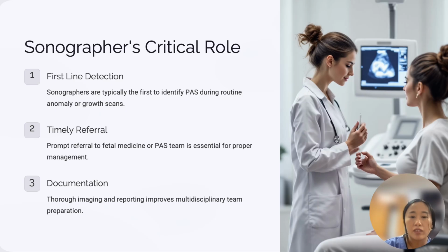So, the sonographers' critical role. We're the first line in detection of this life-threatening condition. Timely referral is important for proper management and documentation. Thorough imaging and reporting will improve our team preparation.